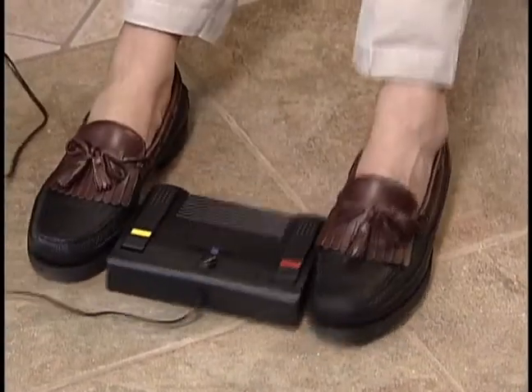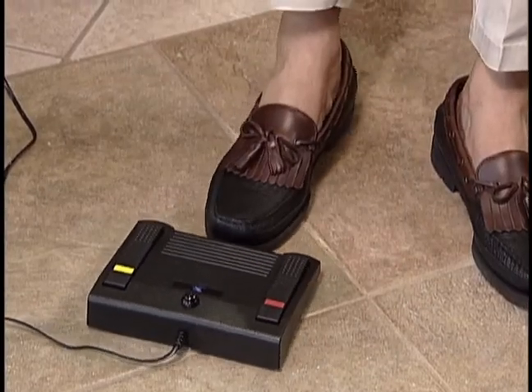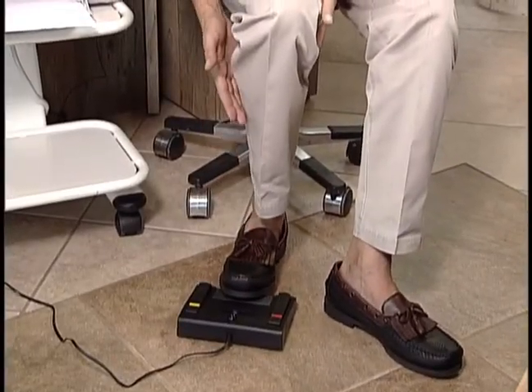Let's spend a minute and talk about the ergonomics of the foot pedal. Okay? Let's go ahead and set the model down because we're not going to need it. And I haven't seen you work yet around the chair. I don't know how much you move around the chair. But it's important that you take the foot pedal with you as you move around the chair. You want this foot pedal farther away from you than you think. If it's too close up underneath you, your foot and leg is in a bind, and that's very fatiguing. So go ahead and pull that around for your use.